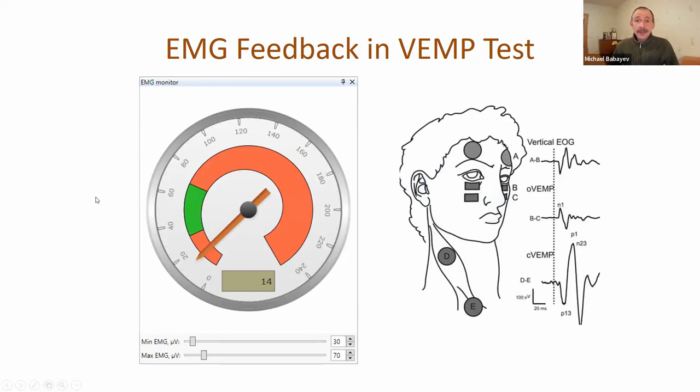We added EMG feedback in the vestibular evoked myogenic potential test. When recording the signal from the neck muscle, it is necessary to maintain the same level of muscle contraction during recording for both left and right sides. Now you can show this EMG monitor to the patient, and the patient's task is only to maintain the level of muscle contraction so that the arrow stays inside the green sector. You can also change the minimum and maximum EMG values online.